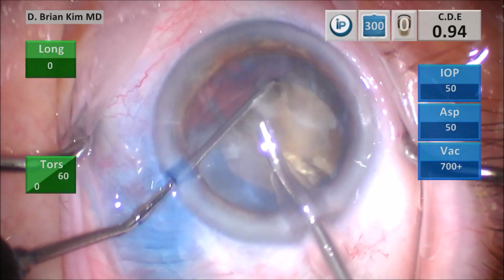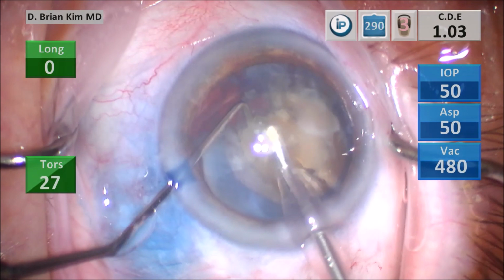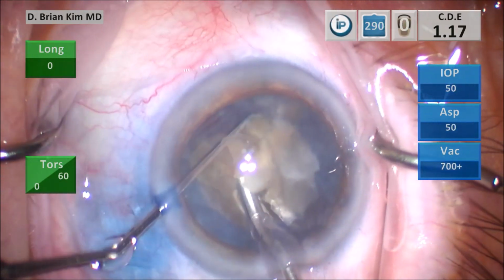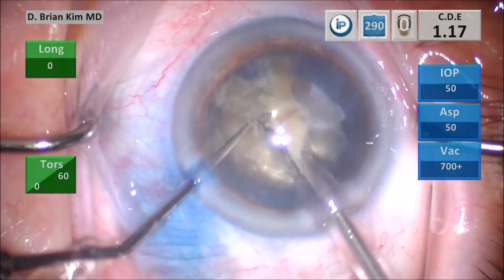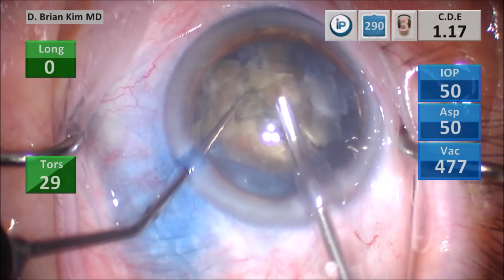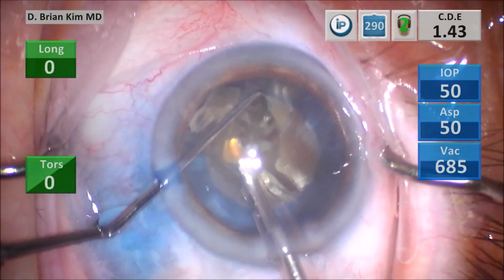Once the fragment is somewhat free there, you see I use some vacuum to lift it up. And then I'm doing this scissoring maneuver where I place the chopper and the phaco tip around the lens piece and kind of amputating the posterior adhesion.